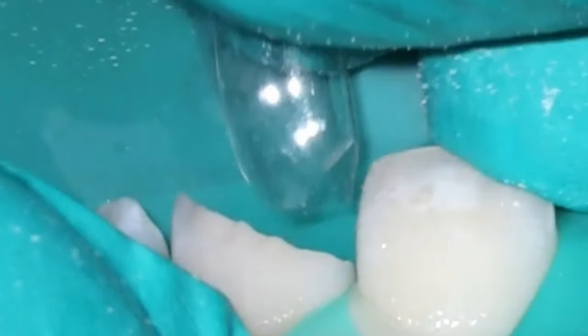All right, this is what the actual matrix band looks like, and it comes with this area fully intact. So on really healthy cases, you actually want to cut out this little triangle to make sure that it's going to fit better with the actual gingiva. On cases that are more broken down, if the gum tissue is not quite as intact, it works perfectly to keep it here.